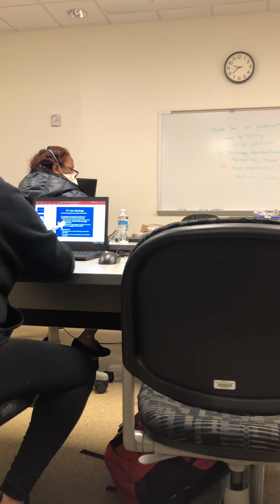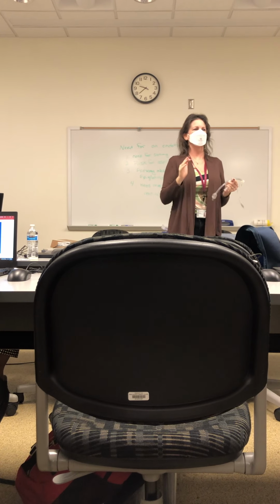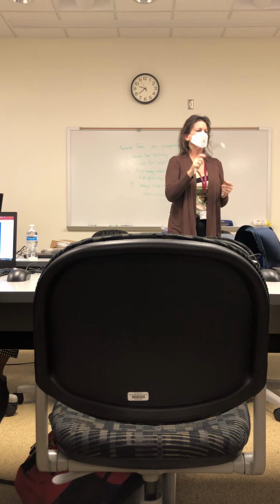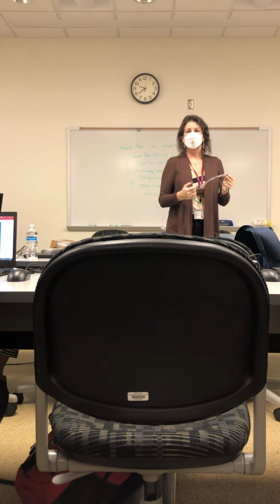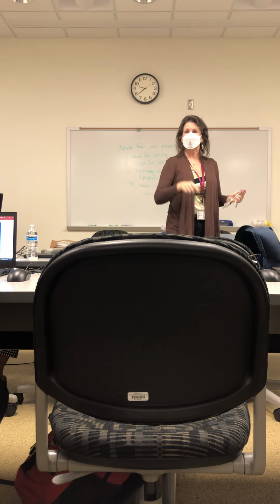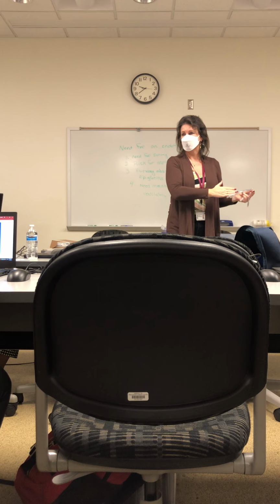Now I'm gonna say this. Whatever institution you work at, wherever they do it at the lip or the teeth, you have to be consistent with wherever you're working, okay? Because if an institution says, we're 24, that's how they'll talk. The therapist will say, well, it's taped to 24. And if she's talking about lip and you're talking about teeth, no, it's taped at 19, there could be a discrepancy. So you have to be consistent with whatever the institution says.